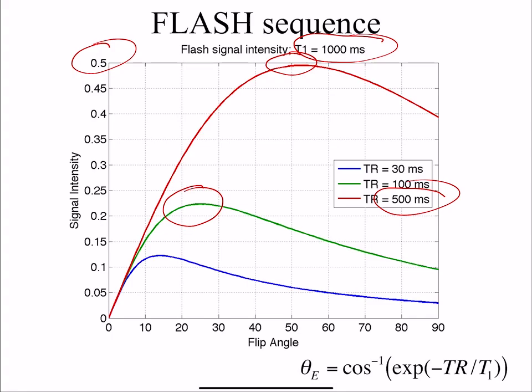Or at the beginning of every exam, there are typically localizers, which are just trying to figure out where your head is. Typically you want those to be very quick, and so they typically use FLASH images. When you go to an MR exam, the first set of images, you'll hear a buzzing, it's just localizing where your brain is. It's taking very quick snapshots of your brain, so that will be using something like a FLASH sequence. Okay.